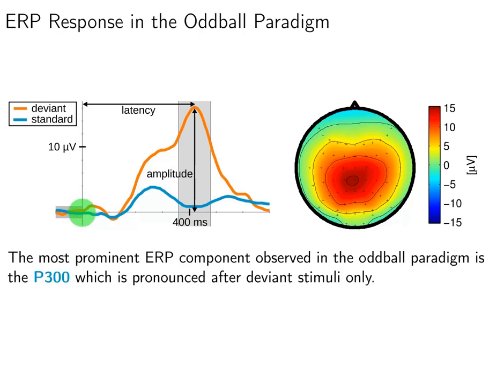If we assume this point, the origin, starts at 0, around 300 milliseconds after it, we will see this prominent response of the brain. And most of the BCI applications use the P300 waveform for building a binary classification or binary BCI, which we can use for different applications, different spelling, control of robots, and others.